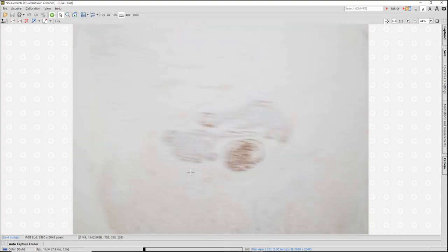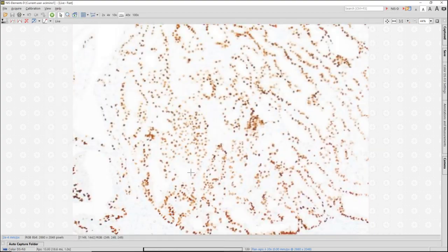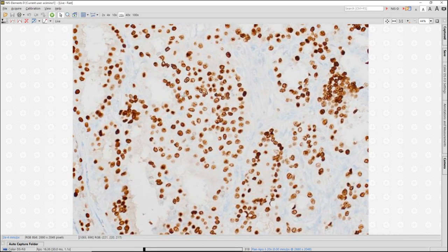ER in atypical hyperplasias will be strong and diffuse in the lesional cells. So here we see this expanded area where all of these cells are actually positive for ER rather than showing patchy labeling like I saw in the usual hyperplasia, right? So this is atypical ductal hyperplasia involving a papilloma.